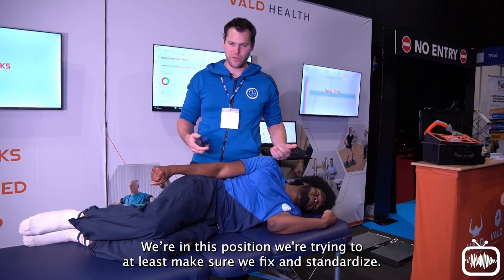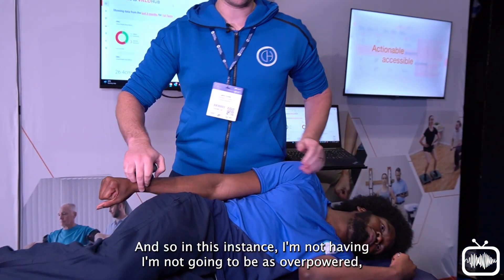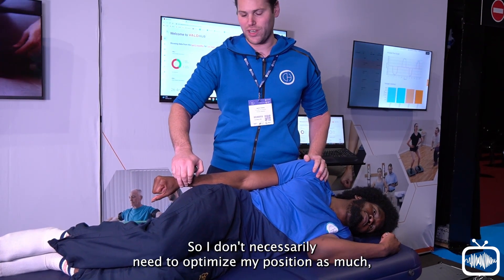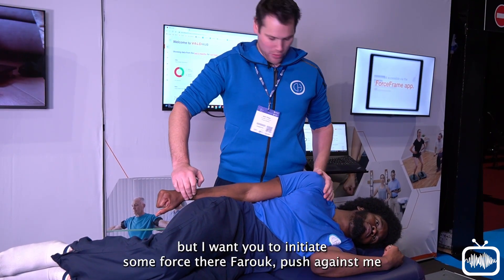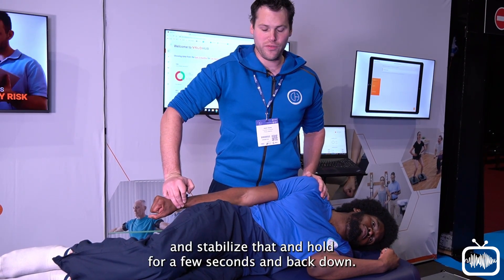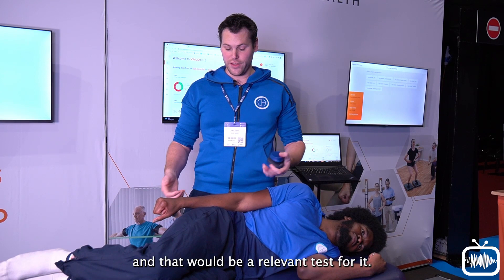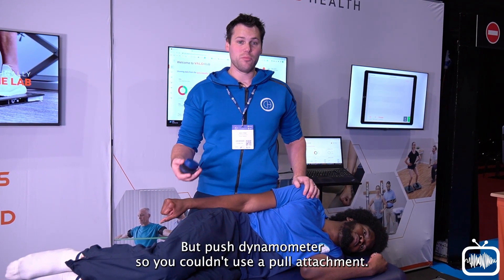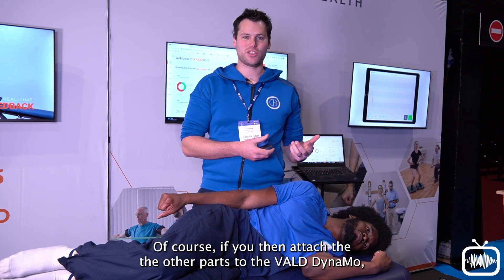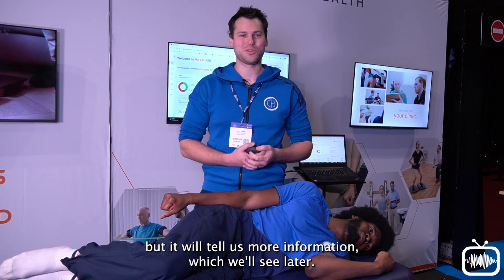In this position, we're trying to make sure we're fixing and standardizing — that's the main thing for retests. In this instance, I'm not going to be as overpowered by the patient on this test. I want them to initiate some force, push against me, stabilize, hold for a few seconds, and back down. That would tell me on the app not just the reading, but also a force curve — a relevant output. With the Dynamo's other pads attached, it can run the same test but provide more information.